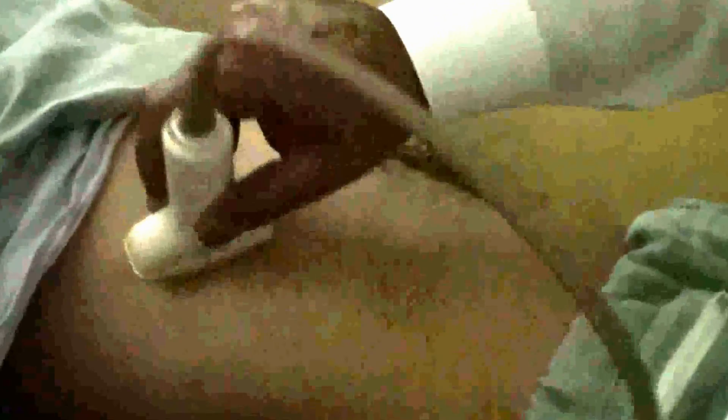This is the subcostal region, from almost mid to lower. You will enter the subcostal region and then angle the probe towards the patient's left side on a little straight, and this will be your angling — to see the diaphragm, the right diaphragm. See this on the ultrasound.